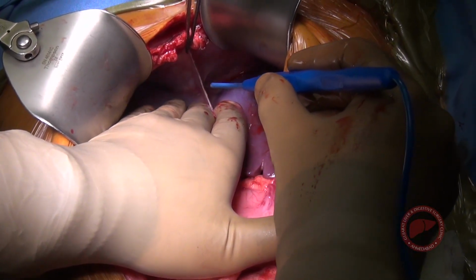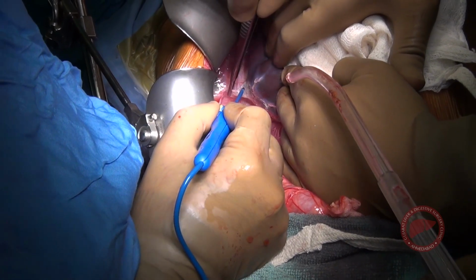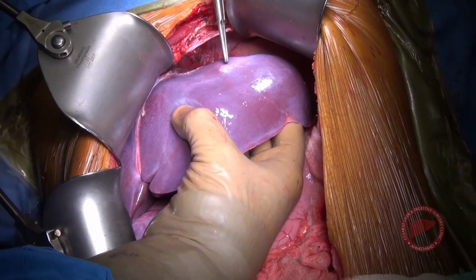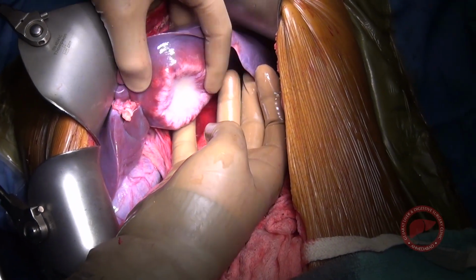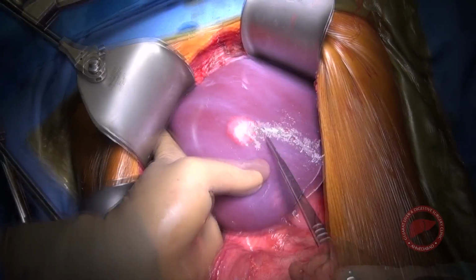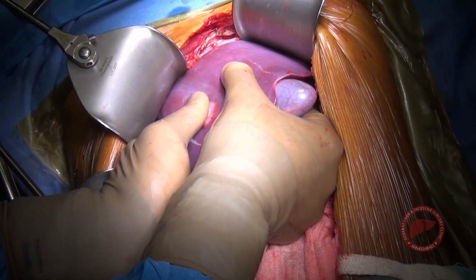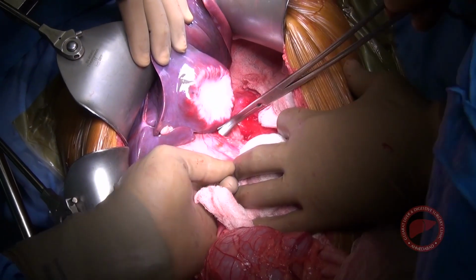Now in the upper abdomen, the liver was mobilized. After mobilization of the liver, you can see here in the left lateral segment there was another nodule which was not seen on the CT scan, and this was a large metastasis in the segment 2 and 3. And on the right liver you can see this was a large metastasis and another metastasis close to the gallbladder. A total of 4 metastases. An umbilical tape was passed for the Pringle maneuver.